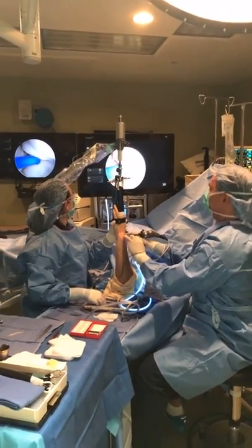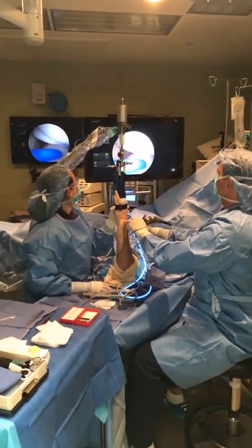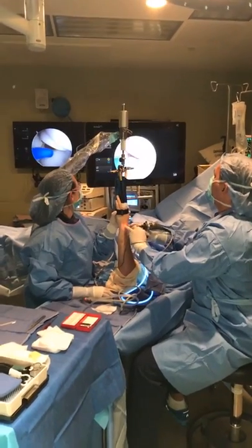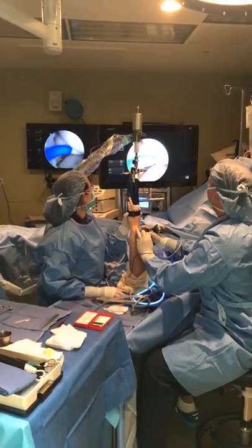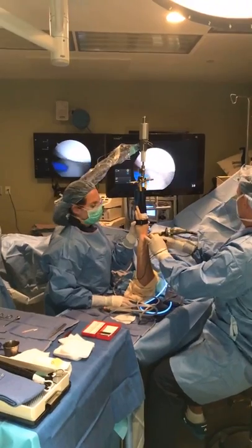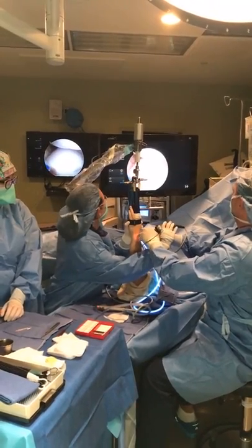This is a bone called the hamate. Am I allowed to say this? Giancarlo Stanton, it was in the newspaper. Giancarlo Stanton, who left us for the Yankees, no comment, broke the hamate, but he had a different part, and that's a surgery that's done open. And then this is a great interval between the hamate and the capitate. Let's get a picture of that.